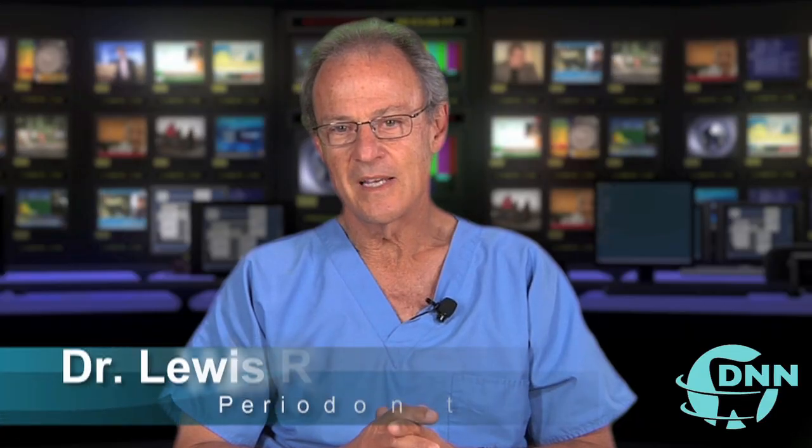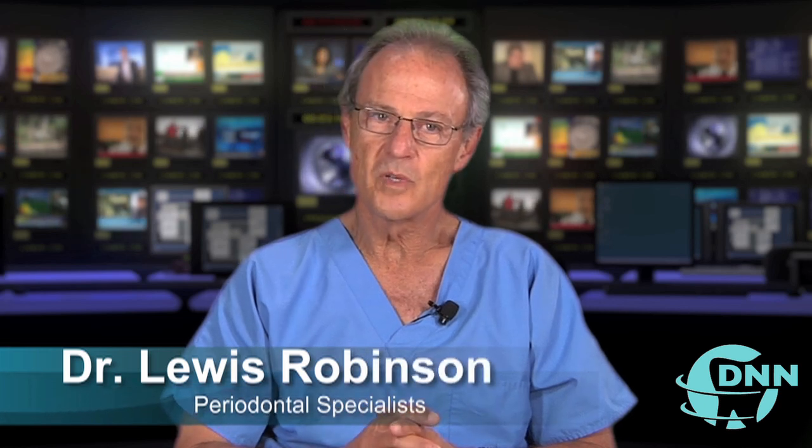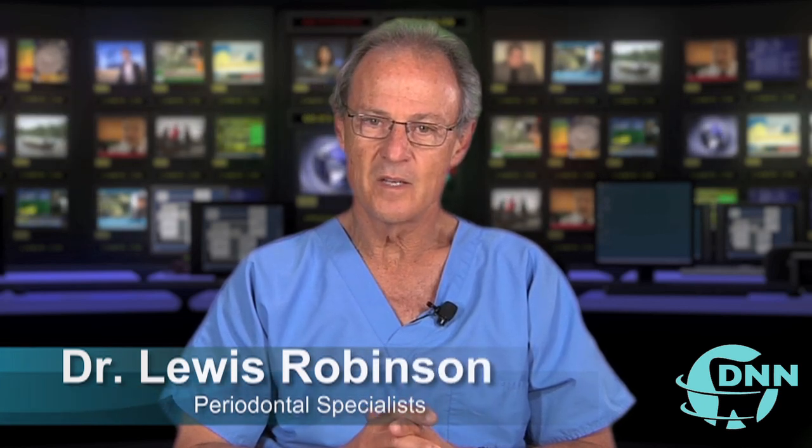It's pretty remarkable. Dr. Robinson, can you talk a little bit about the aesthetics and the overall functionality? Do these new implants perform the same way as the old ones? The old dental implants gave us one really very important principle, and that was that these metal objects could be screwed into the patient's jawbone, and they would become, the term's called integrated, fused to the bone, and they would be very strong and very stable, and then we could attach various types of dental appliances, either removable prosthetics or individual teeth, to those implants. But they were not very aesthetic.